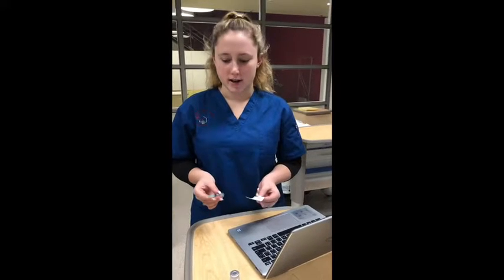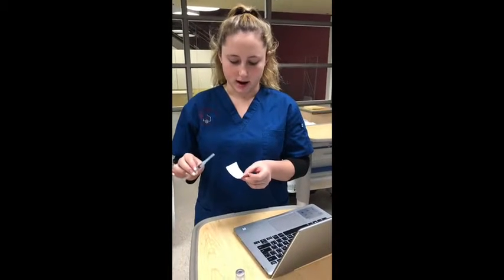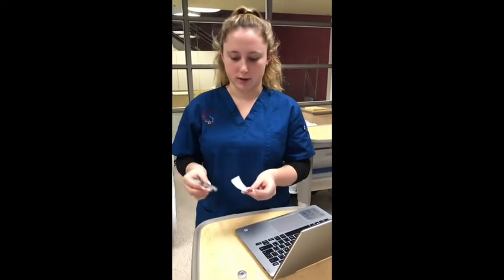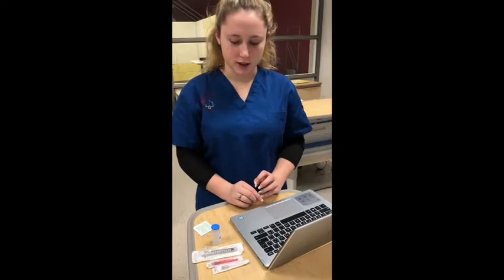The last thing I'm going to do to prepare for the subcutaneous injection is to make a label for the injection that has Mr. Mancini's name, the drug that he's receiving, and the dose, and I would attach that to the needle. So now I'm going to assemble my syringe and my needle for my intramuscular injection.